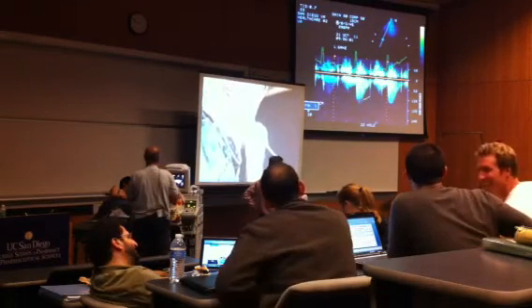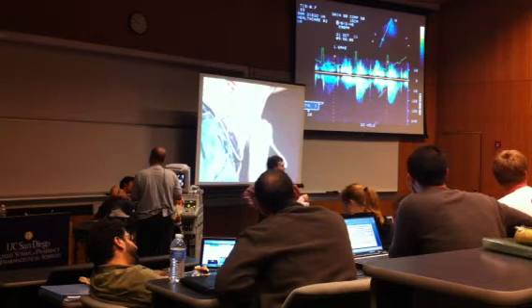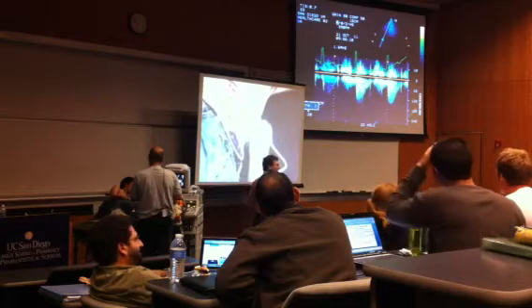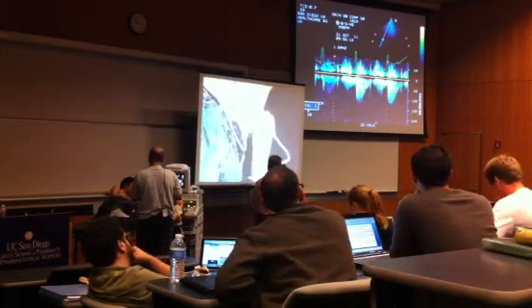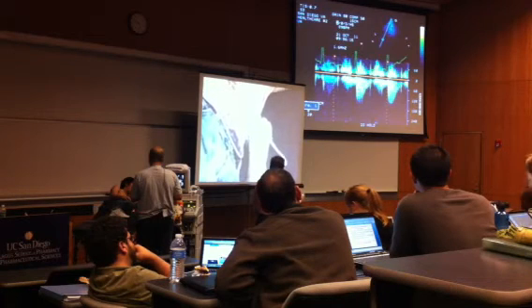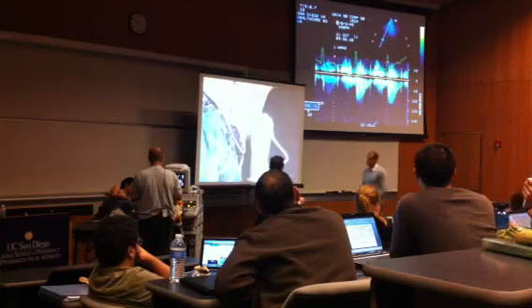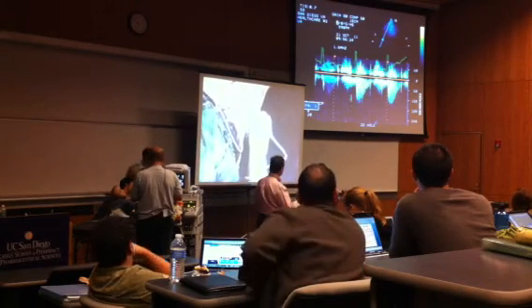The aortic valve opens, this sharp peak, and then we have ejection out the aortic valve. So again, this tells us about components of the Wiggers diagram that we can measure. Here we can see our flow out the aorta. Here's the beginning of systole. We can measure our ejection time during this interval here from the aortic ejection.